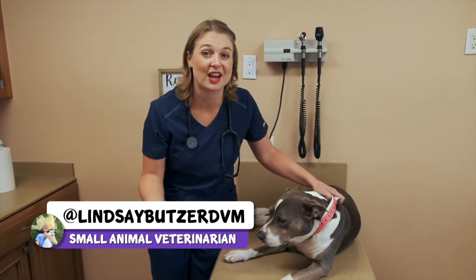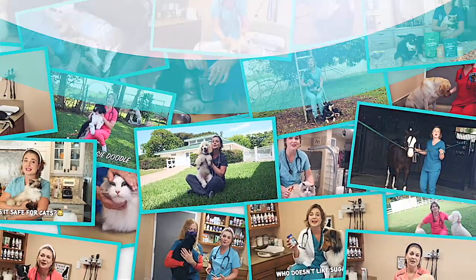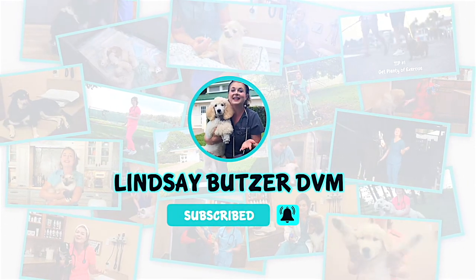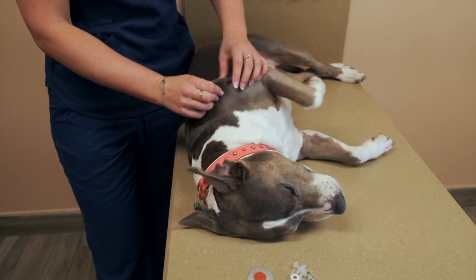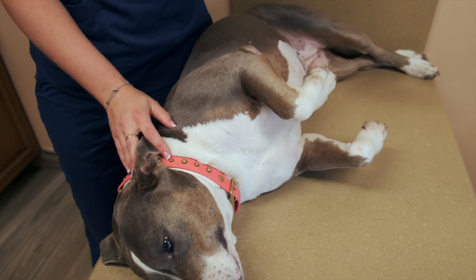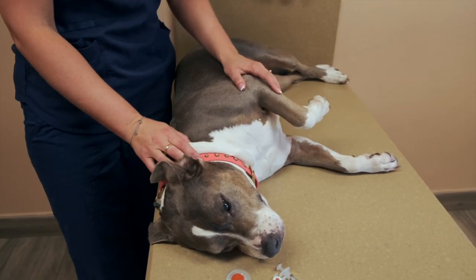How to give a sub-q injection, or a shot under the skin. This is Bella, she's going to be our doggy actor. She needs allergy shots given in her sub-q layer under the skin. You might be watching this video because your dog needs to get an allergy shot which your veterinarian said was okay for you to administer at home. This can be scary for some owners, so that's why I made this video.